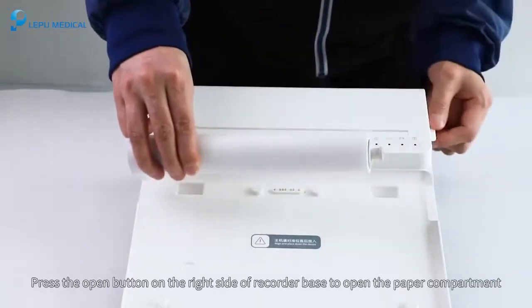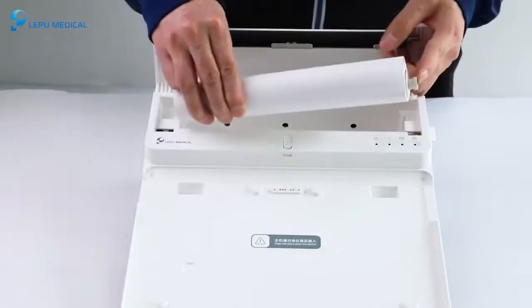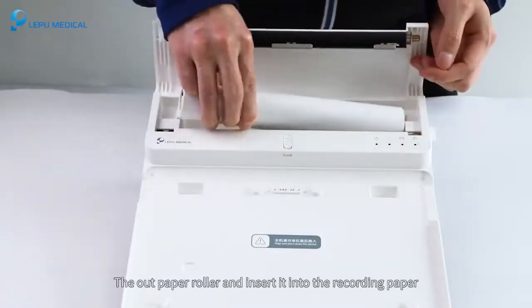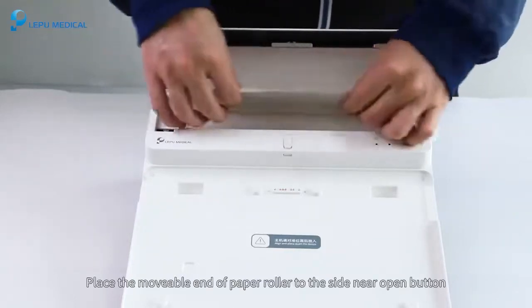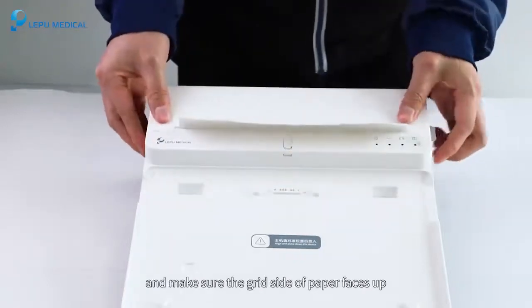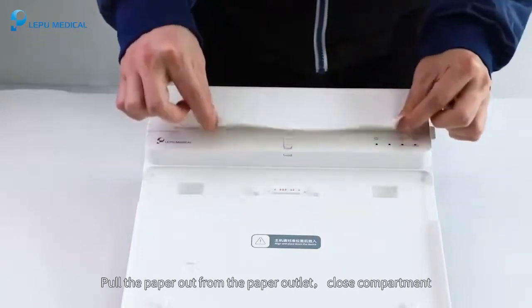Press the open button on the right side of the recorder base to open the paper compartment. Remove the tape on the new recording paper. Take out the paper roller and insert it into the recording paper. Place the movable end of the paper roller to the side near the open button, and make sure the grid side of the paper faces up. Pull the paper out from the paper outlet, close the compartment.